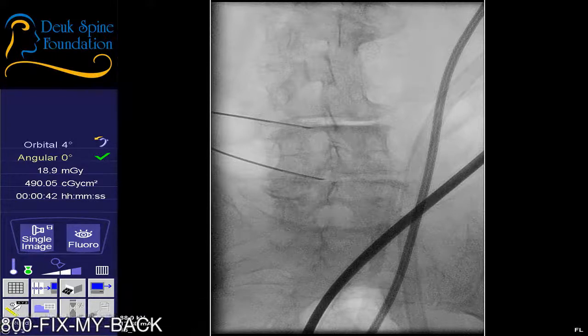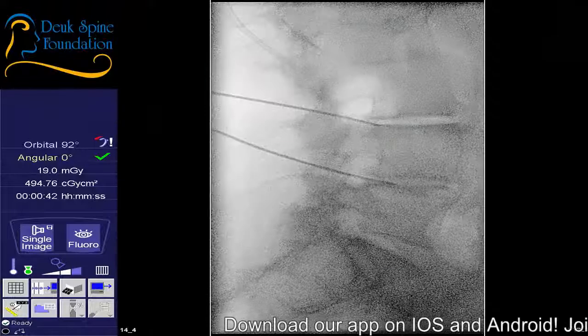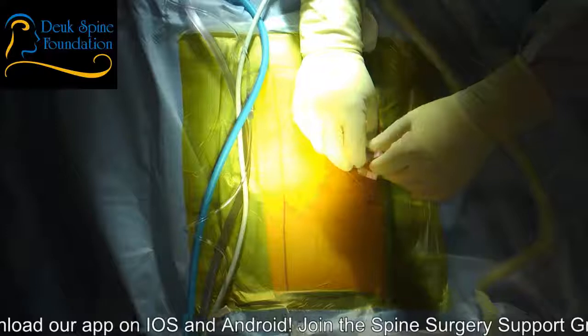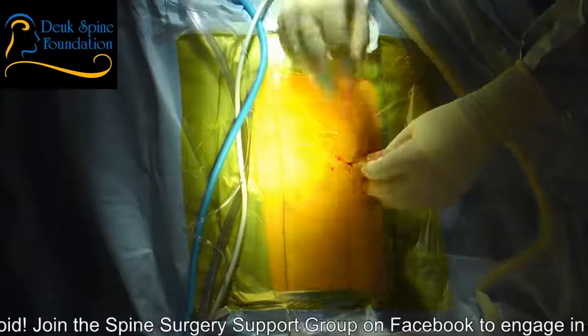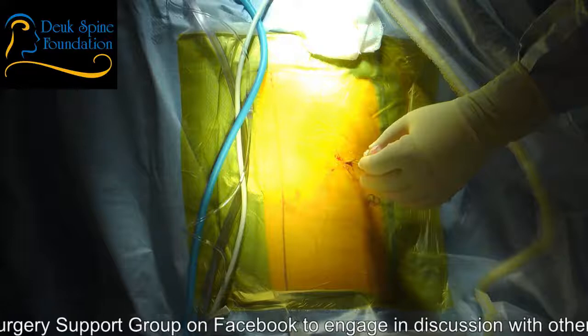All right, so we are close to the midline, but we are rotated. Let's go back to the lateral view. Well, we're definitely getting into the disc, but I'm not entirely happy with where we are. The question is, is this the best we can do given the anatomy? I feel I can reach this place again if I needed to. So I'm going to come out and see if I can't do a better job.